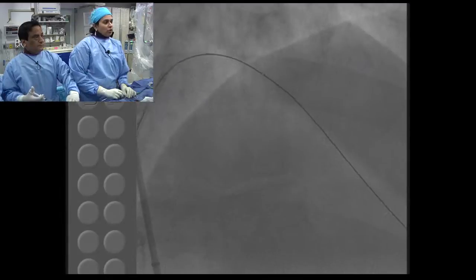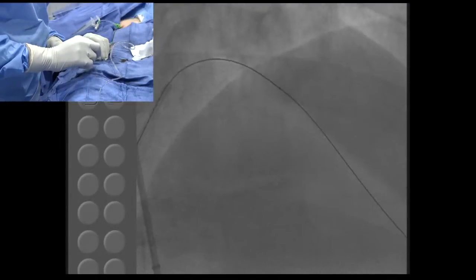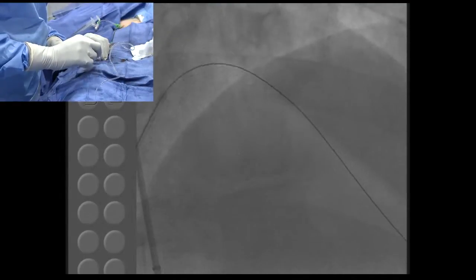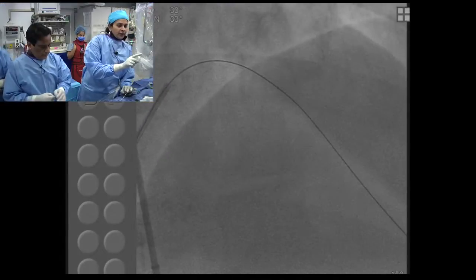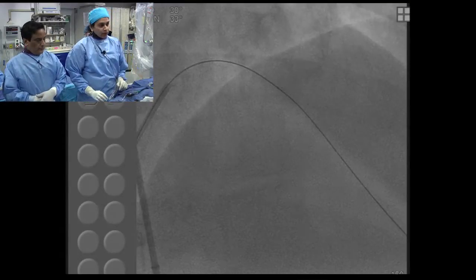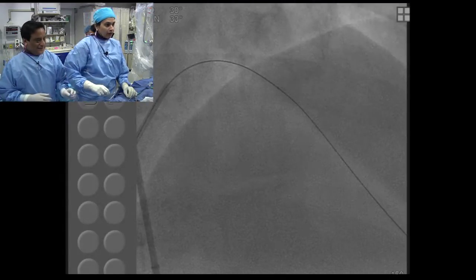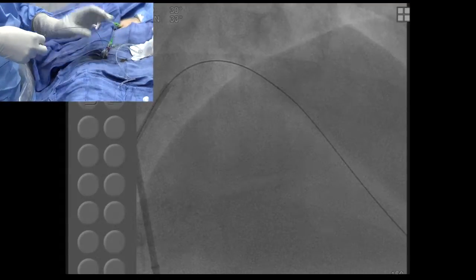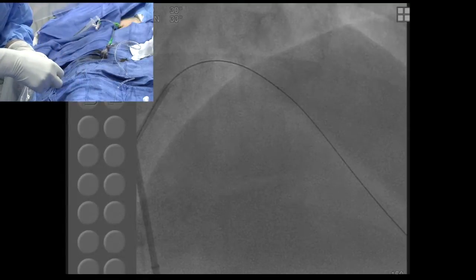So I have the 1.2 balloon. Yeah. And it does not go. See that? So I'm going forward. This is exactly where the Fine Cross had trouble. So there are two ways you can do it. One, you can dilate here and then keep progressively going forward. Or the other way is using mother and child. I can show you that by doing that it will go further. But for that, everything has to come out. Means there's a drawback. Your balloon has to come out.